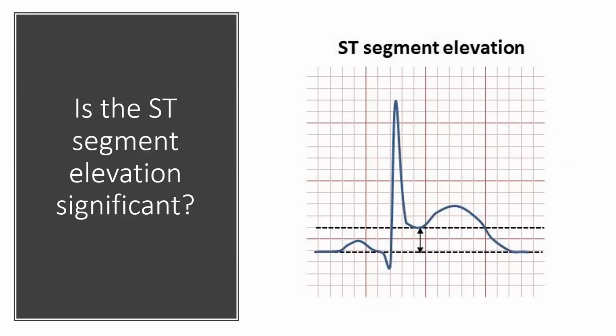Is the ST segment here significant? Could you please answer in the chat box? All right, everybody seems to agree that it is significant. And the reason is because the ST segment elevation is 2 millimeters. And therefore, this is going to be a significant ST elevation.